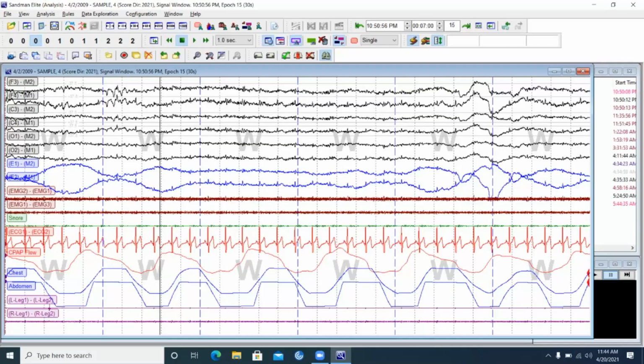So when we work through this page, I'm on page 2 of this lab. Remember, sensitivity is inversely related to height, because your sensitivity setting is a reflection of the voltage coming through from the signal. It's a display of how big it's going to be on the screen.